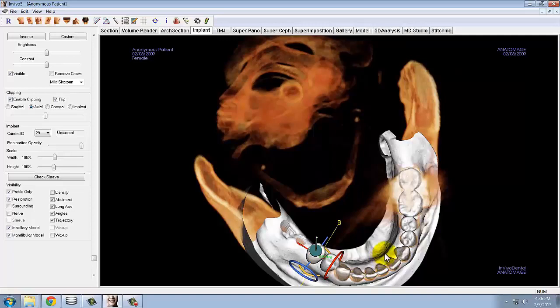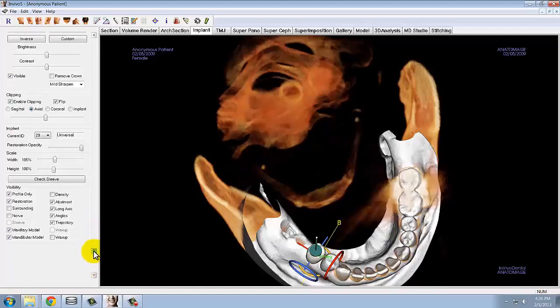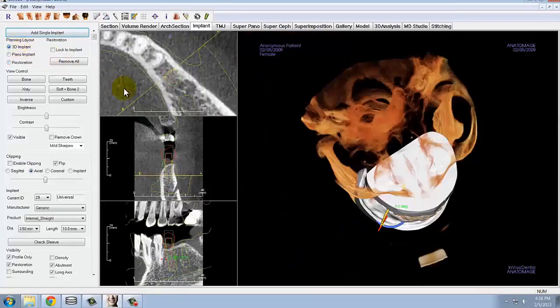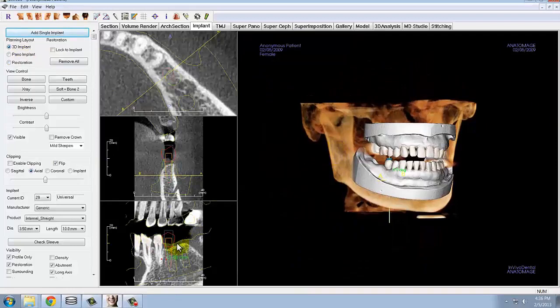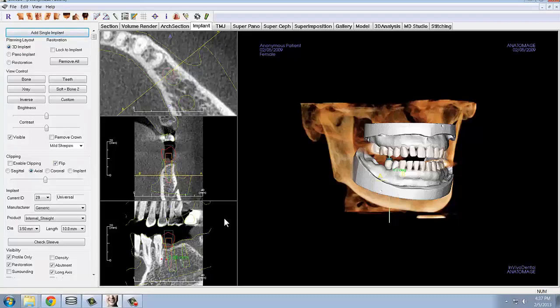Now that you have placed the restoration in its ideal position, fine tune the implant position to adjust for the best trajectory through the restoration, as well as following the suggested implant treatment planning elements. You will need to be in the 3D implant planning view to adjust the implants, and go back to the restoration view in order to adjust the restorations. Keep the following in consideration as you fine tune your implant plan: the space between implants, other implants, and adjacent teeth; reducing angled abutments as much as possible; and ensuring that the trajectory of the implant through the restoration is best through the cingulum or incisal edge.